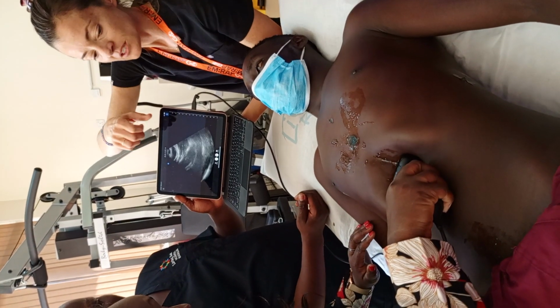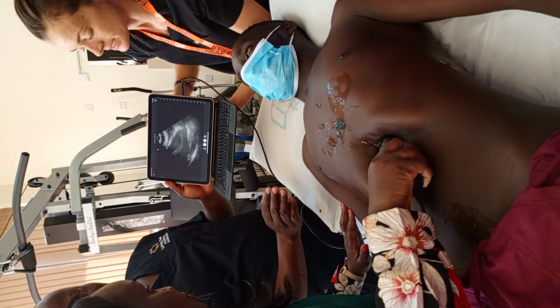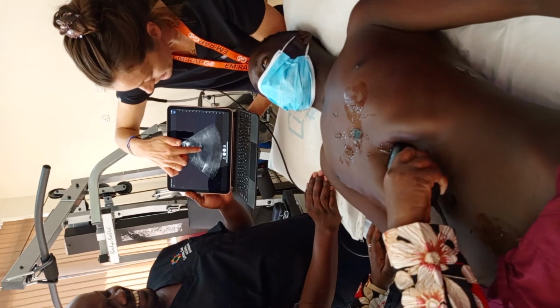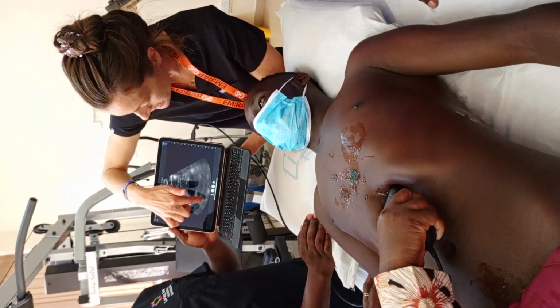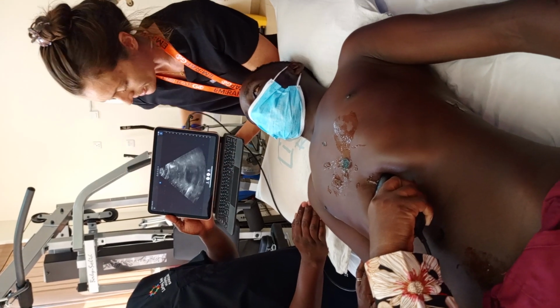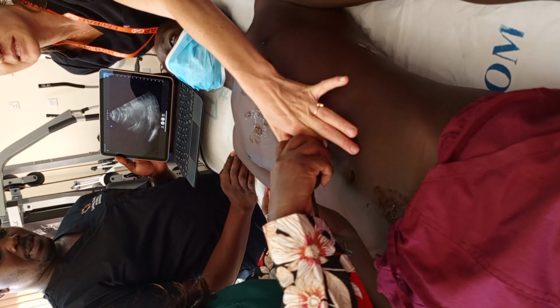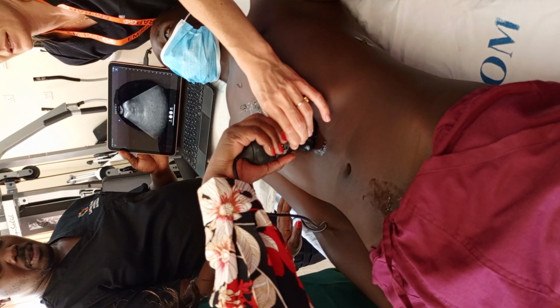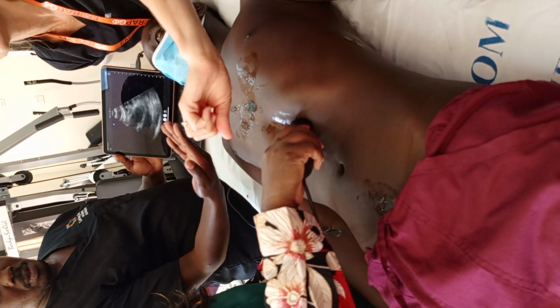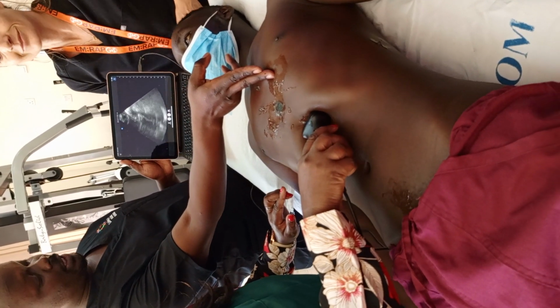The way that I think about this view is almost like you're taking a spoon and scooping under the xiphoid process. And you have a great view right there. So there's our heart. We see cardiac motion. And again, we don't see any big collection of fluid around the heart. And then just remember, if you did subxiphoid and pointing like this, is that going to get his heart? No, his heart's up here. That's why we have to aim towards the heart. Beautiful.